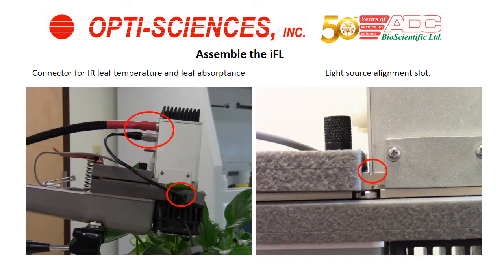Next, mount the light source for the IFL onto the LC-PRO SD leaf cuvette chamber. The unit has an electronic connection that allows collection of data from the bottom of the leaf chamber to the IFL. Use the connectors as shown and plug them in place. When mounting the light source, as shown on the right-hand side, the slide fits into a slot in the chamber.